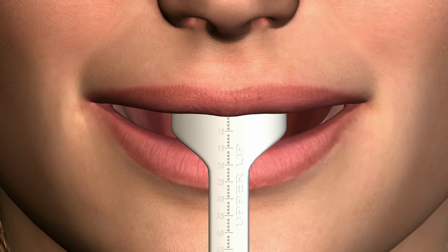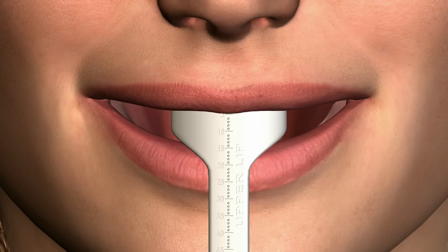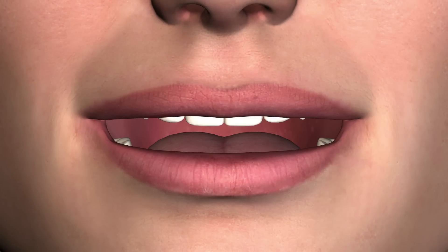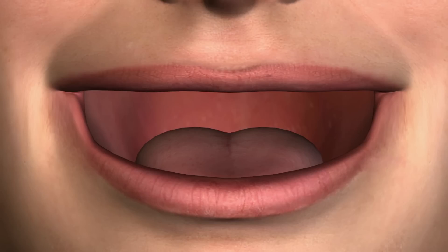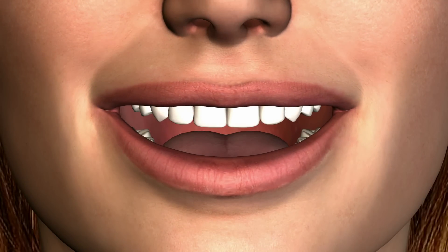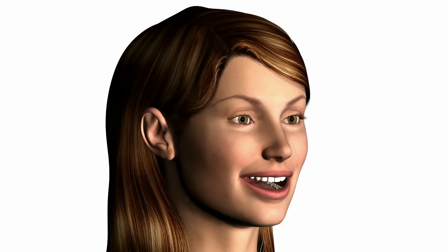Then have the patient display a full smile and record this measurement as the smiling lip position. A patient with a small or negative animated lip measurement may by necessity display some gingival tissue in the final prosthesis. Conversely, a patient with a large resting lip measurement may display very little or no tooth at rest. Knowing these readings and their implications, the patient can be fully informed of the cosmetic limitations of the treatment planned.